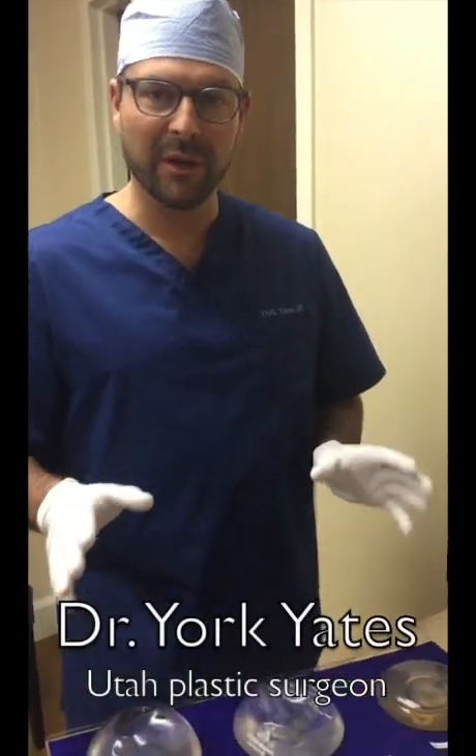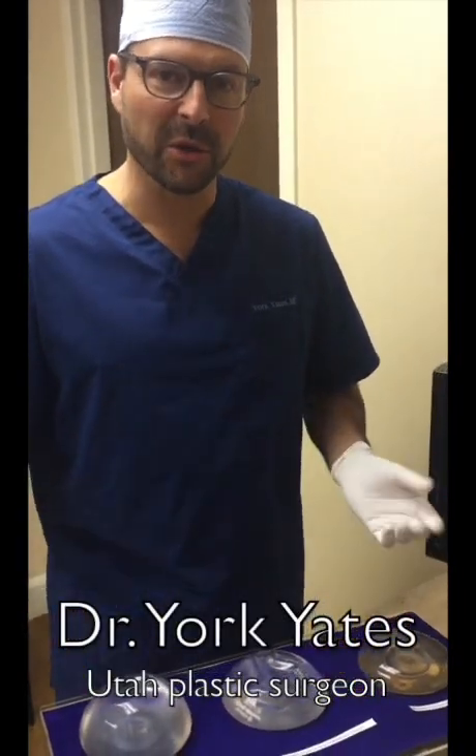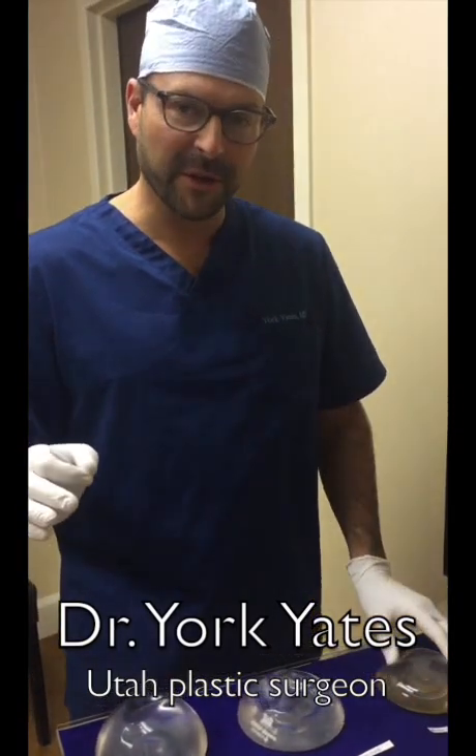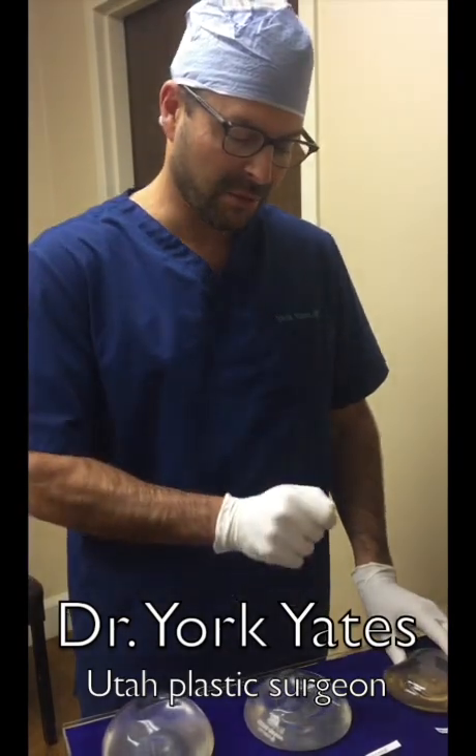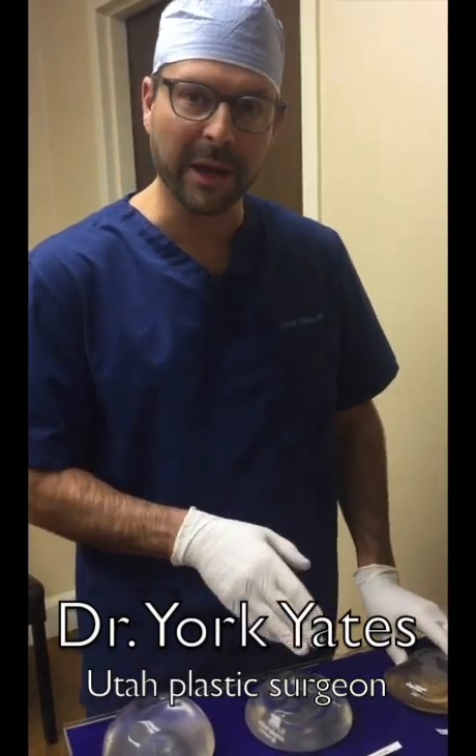Everybody always wants to know: if my implant ruptures, what's the silicone going to do? Today we're going to do a really fun experiment — we're going to slice a bunch of implants, compare brands, squeeze out the silicone, and watch what happens.